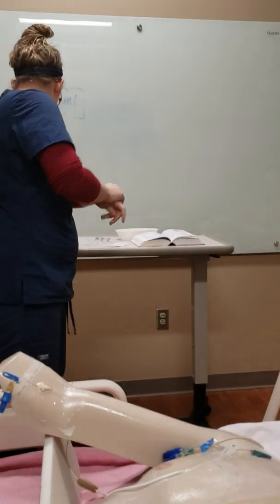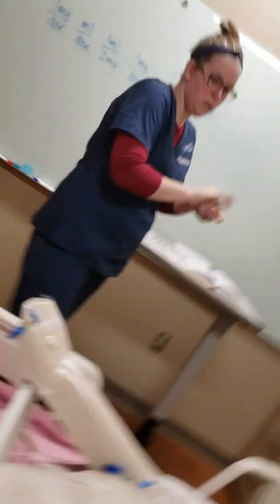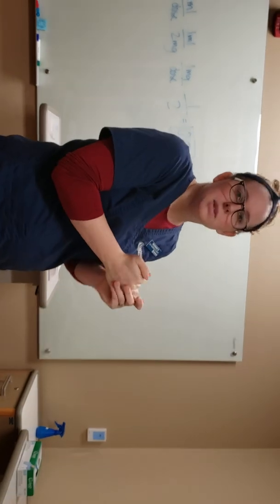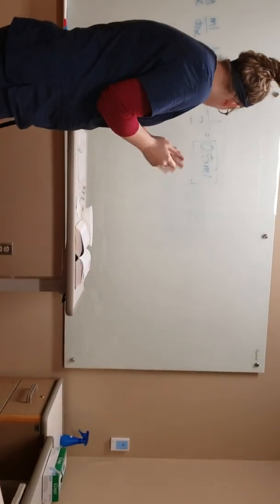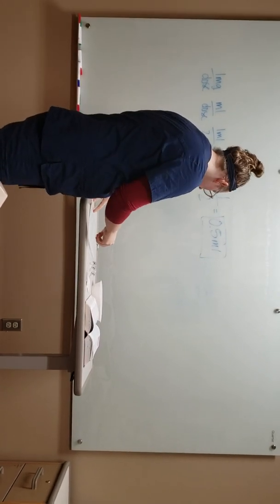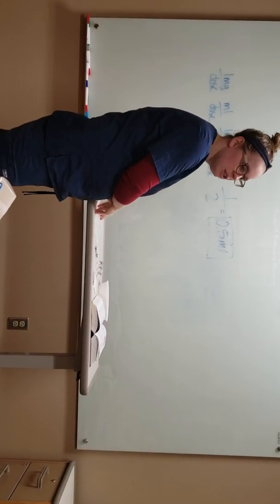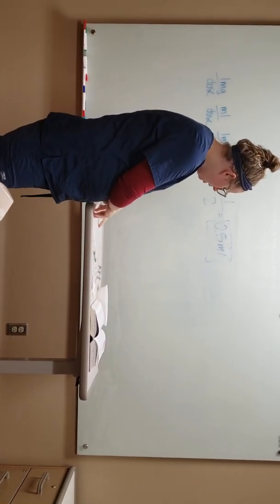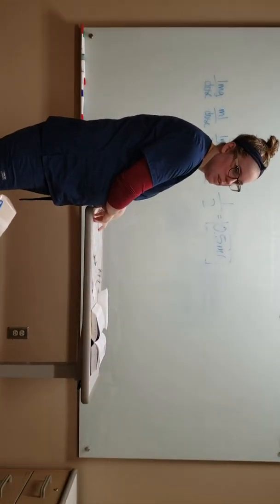Okay, so for the sake of this video, we're going to say that my patient's name is Mary. Okay, Mary, I have an order from your doctor. It's reported that you're having a little bit of pain, that you've rated your pain as an 8 out of 10, and you do have an order for hydromorphone, which is Dilaudid.